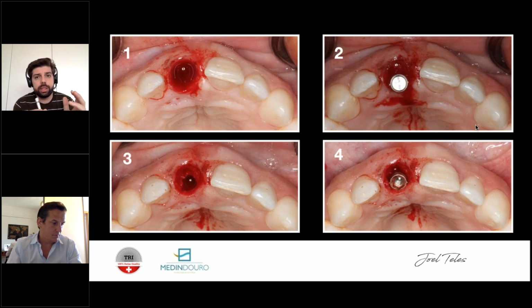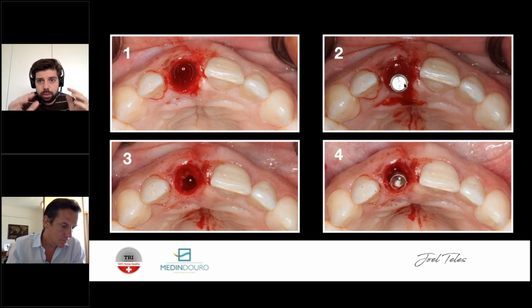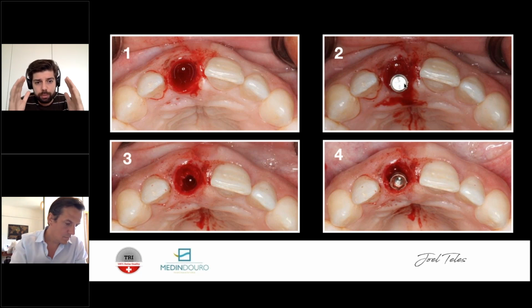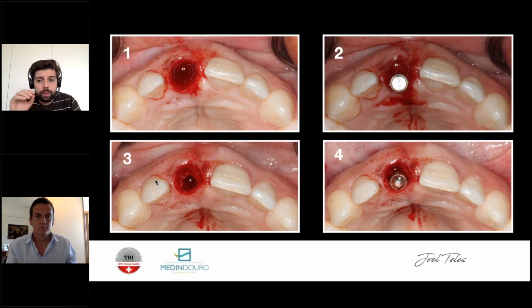Like a resume of what we're discussing, in the shape of 1, 2, 3, 4, this is normally what I do. You extract your tooth, trying to keep everything in place, trying not to harm the tissue. And you can see number 2 here, the orientation for my implant. Remember, the right prosthetic position for your implant, if you consider the perfect crown positioning, is touching the palatal side of the socket and not following the root, because remember that Kan classification, normally the roots are much more toward the buccal side of the bone. And in number 3 you can see that clearly. You can see right there on the bottom where your root was, and you can see the new alveolum that we've created for our implant.